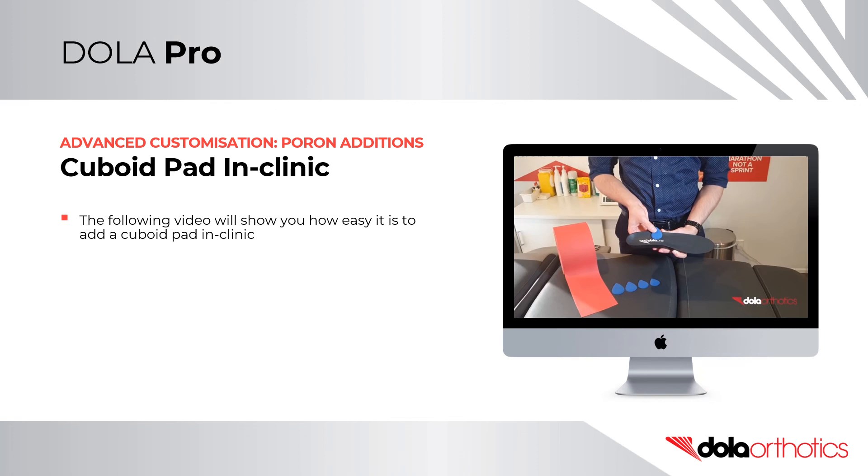Cuboid Pad In-Clinic Modification. Adding a cuboid pad to an orthotic shell is a common in-clinic modification. The following video will show you how easy it is to add your own cuboid pads in clinic.